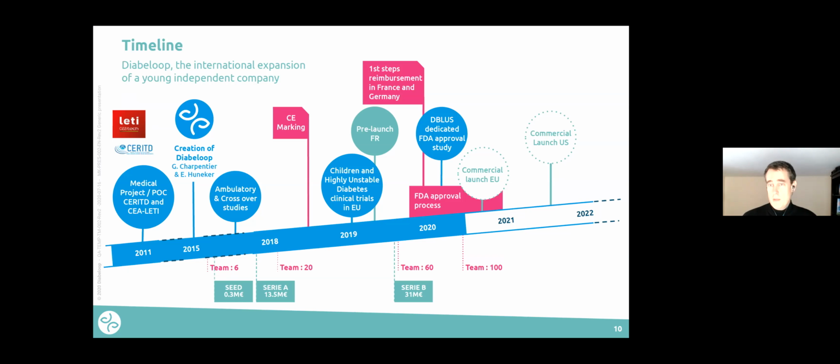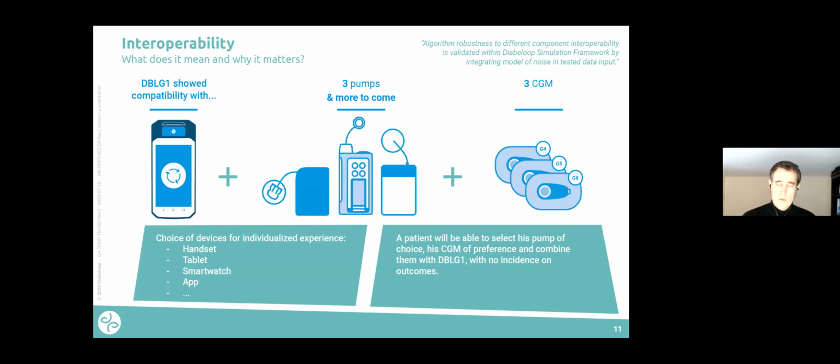We're adding more pumps, and that's one thing that I wanted to focus on: the whole philosophy of Diabeloop is that it's a choice of the people living with type 1. And so when we talk with people from OpenAPS, Android APS, Loop, choice really, really matters. It matters obviously because every person is different. It also matters because in some countries, there's only certain pumps that are distributed or reimbursed. So it's also a matter of access.